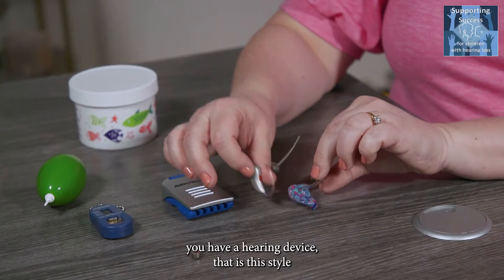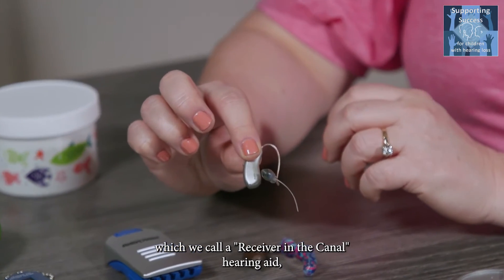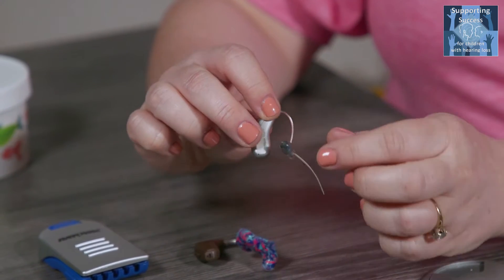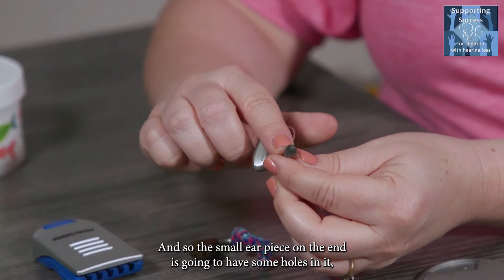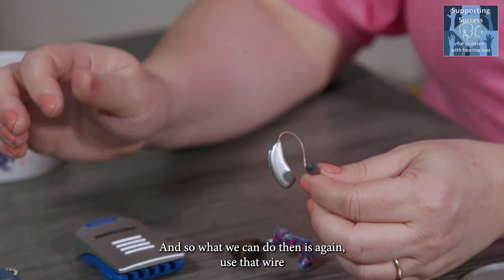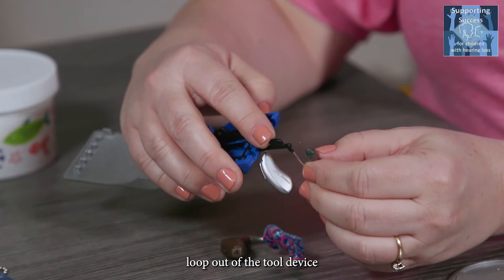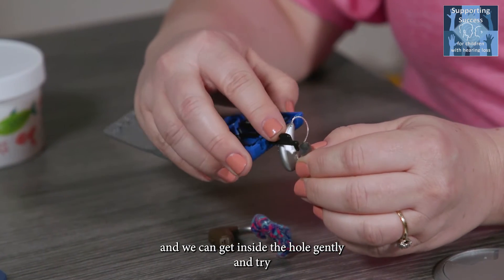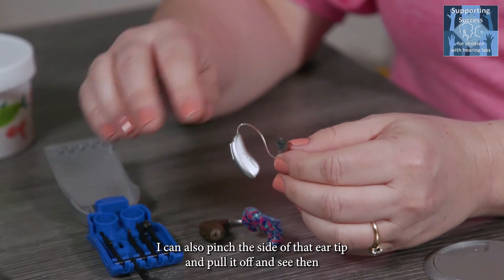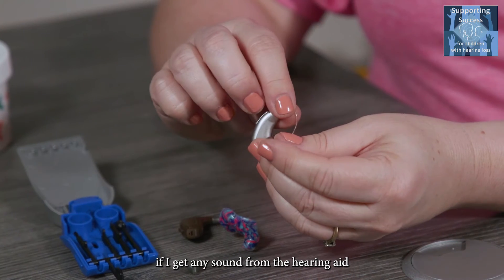If you have a hearing device that is this style — called a receiver-in-the-canal hearing aid — you have a small wire inside the tube and a different looking earpiece. This small earpiece has holes in it, especially at the very tip, for sound to come through. You can use the wire loop to gently get inside the hole and try to remove any wax from the ear tip. You can also pinch the side of the ear tip, pull it off, and check whether you get sound from the hearing aid.